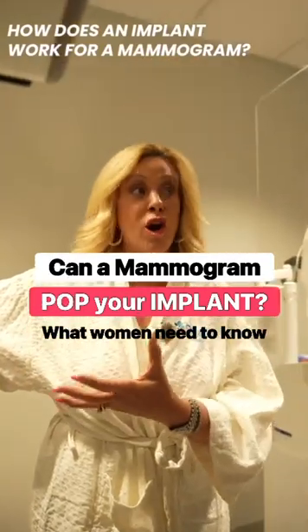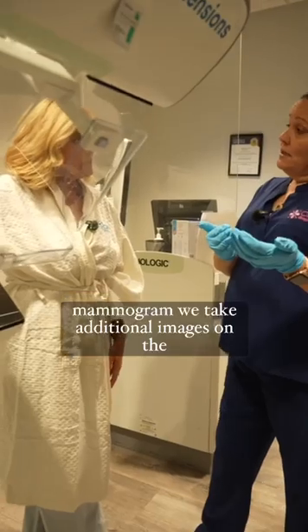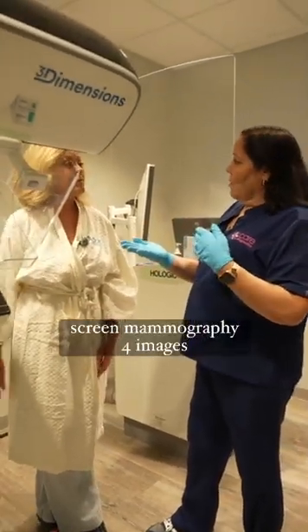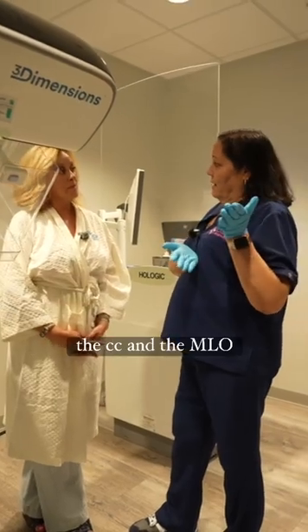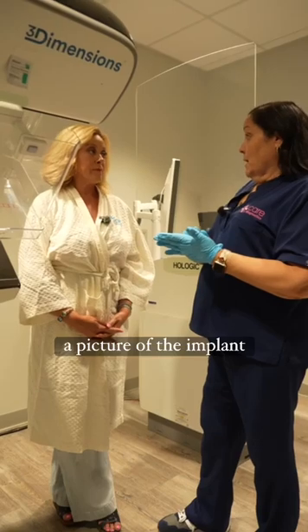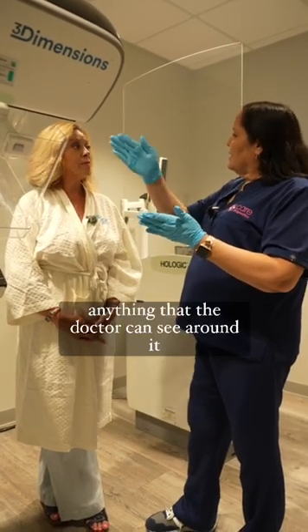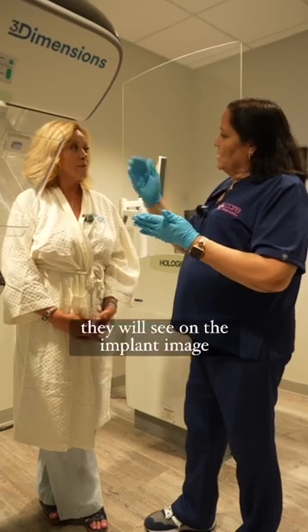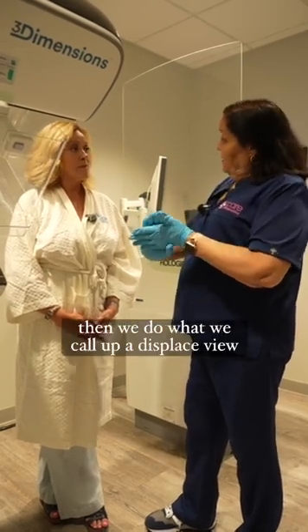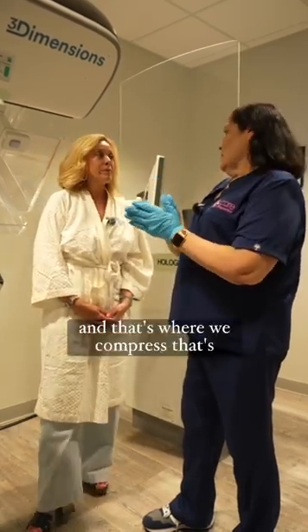How does an implant work for a mammogram? The same as a standard mammogram, but we take additional images. With a standard screening mammography, you get four images: the CC and the MLO. On the implants, we get a picture of the implant in each view to check for leakage, so the doctor can see around it and through it. Then we do what we call a displaced view, which is where we get the tissue in front of the implant — and that's where we compress.